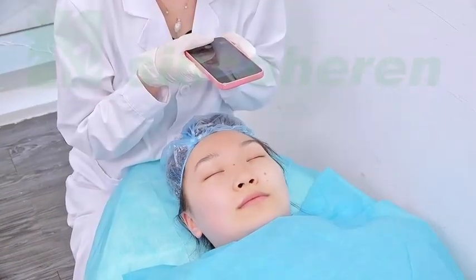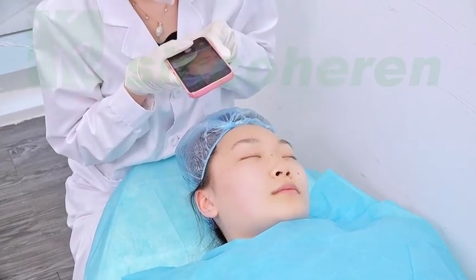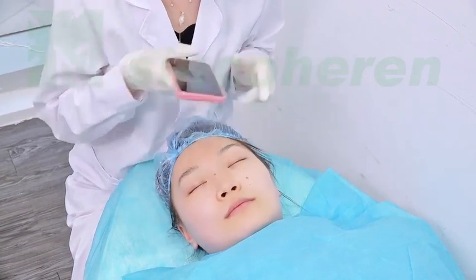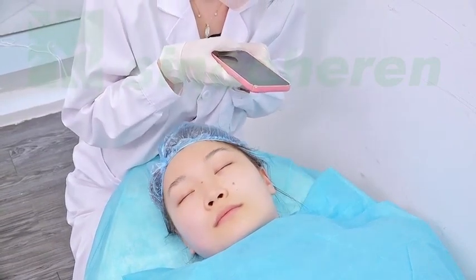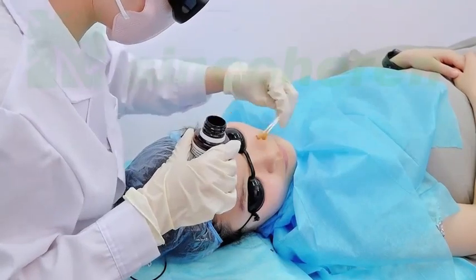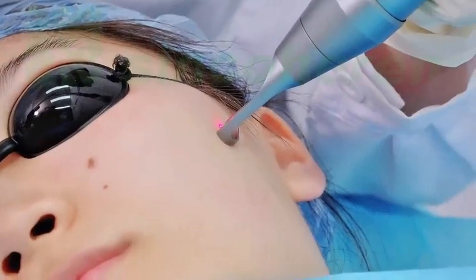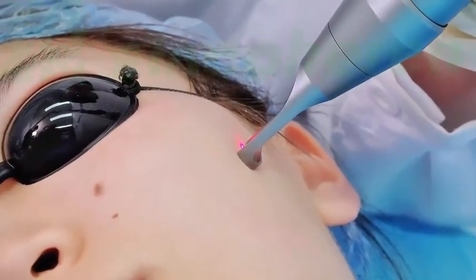The doctor is taking photos of the patient. After doing the clean work, the doctor should take photos. We recommend using a skin analyzer to take photos. The doctor is disinfecting and cleaning the treatment area. Before treatment, the doctor is doing sensitiveness testing.